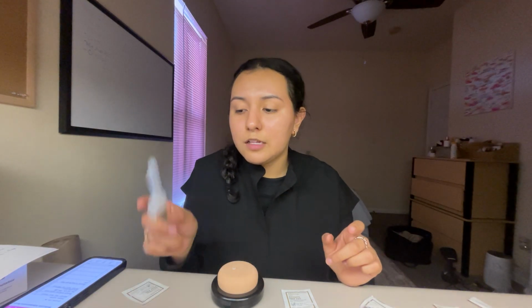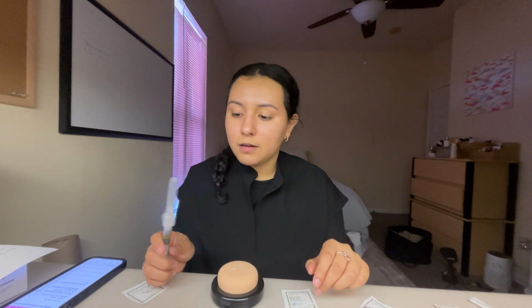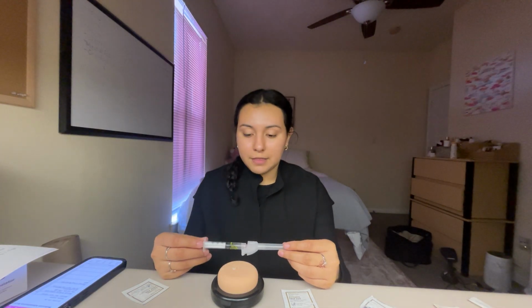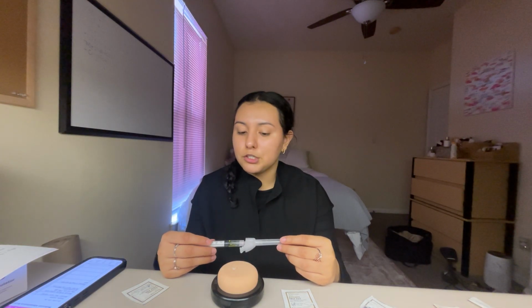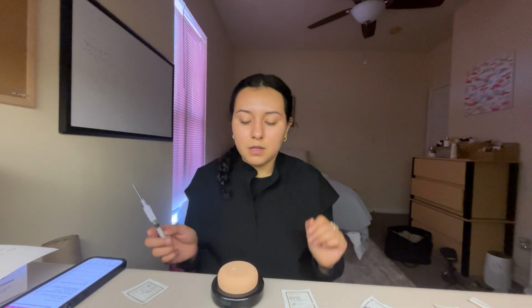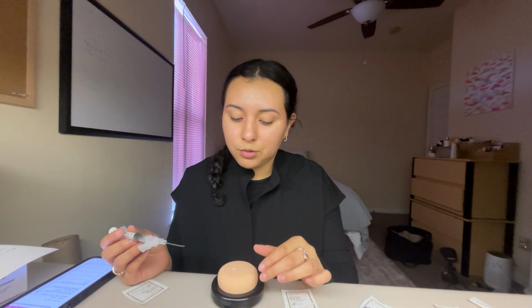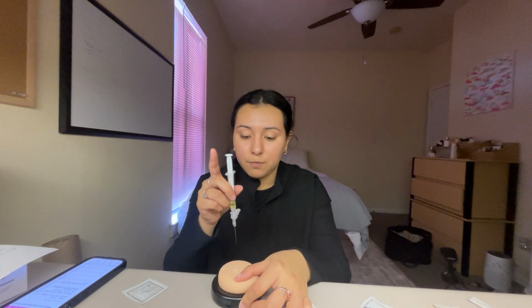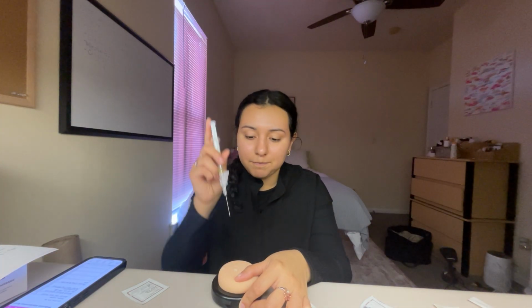And then last but not least, I have Demerol. For Demerol, we are going to use the Z-Track method. We are going to remove our cap. And for this one, we're going to kind of hold our skin to the side, and then we're going to insert it at a 90 degree angle. We're going to do it fast and quickly.